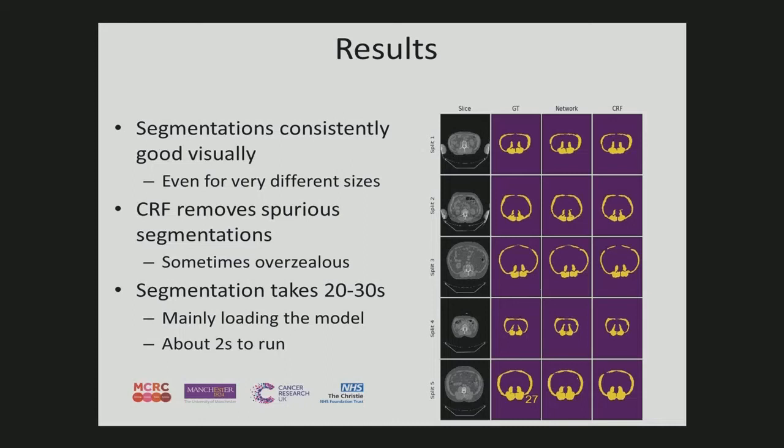Yeah, question. Do you know how this sort of segmentation lines up with the manual one? Yeah, well, it was trained on the manual ones, and we have the data very well, but I don't know it by heart how well.